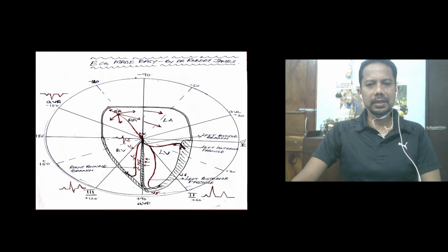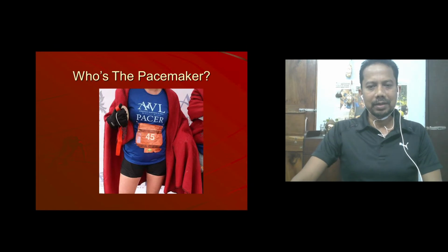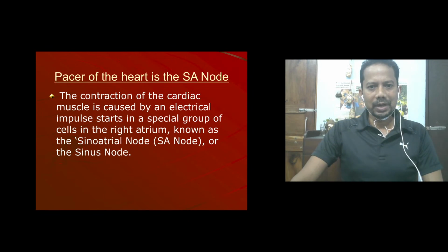One of my seniors, my teachers, used to calculate the axis using the tan theta method, and since then I was very curious how it works and how we use it. Anyway, we came to know and I have taught you, so we can bypass these.